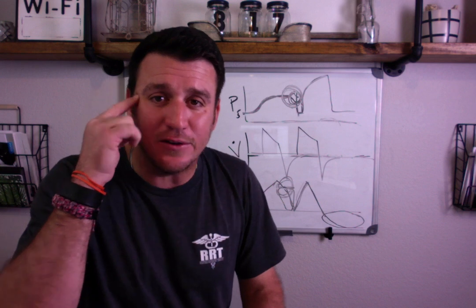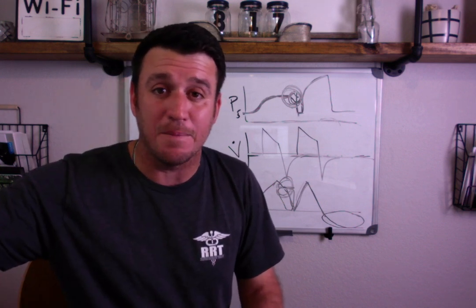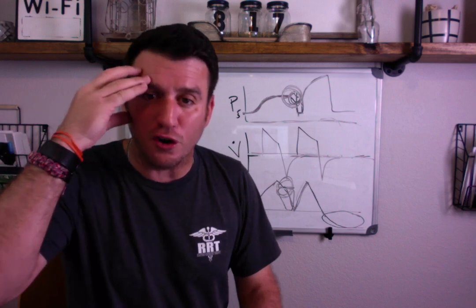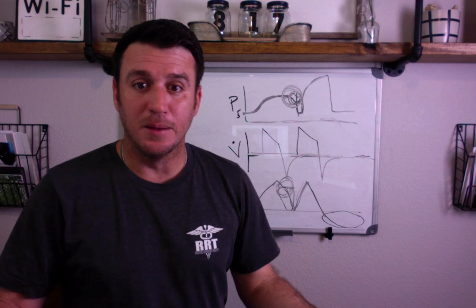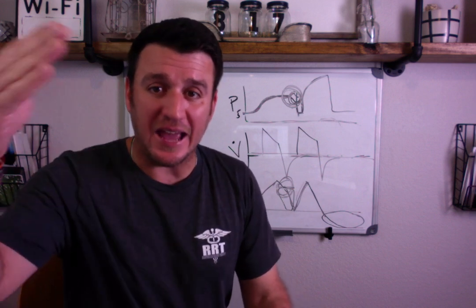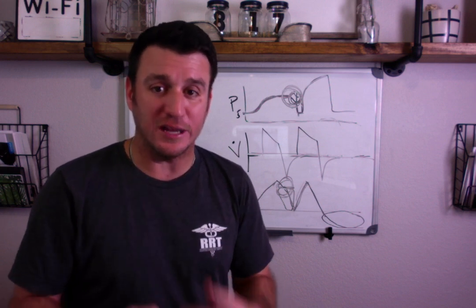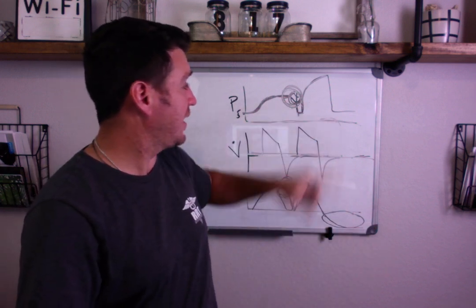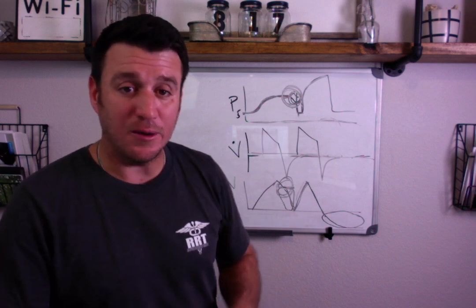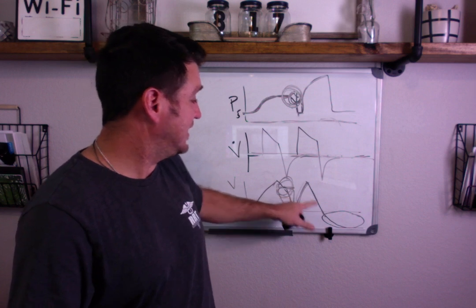You cannot tell the brain to breathe differently unless you sedate it and completely knock it out. If the neural drive to breathe is there, but you cut it off at 80% of what they're wanting, then if you're in assist control, they're going to trigger another breath. And what you get is this steep increase in pressure and this additional tidal volume.